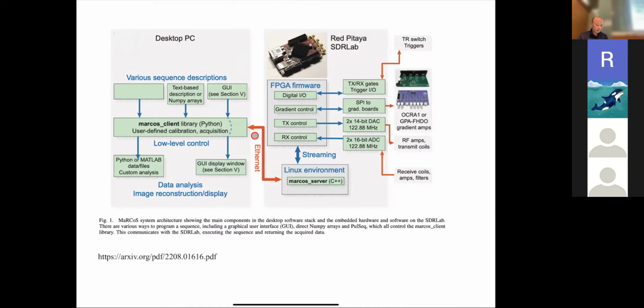Okay. There is a push in healthcare, there's sort of two pushes, right? In research, you're always going for stronger and faster and better. But in terms of clinical care, you're looking at what benefits most of the population at the best cost. And so then there's a push to what's called point of care, POC.